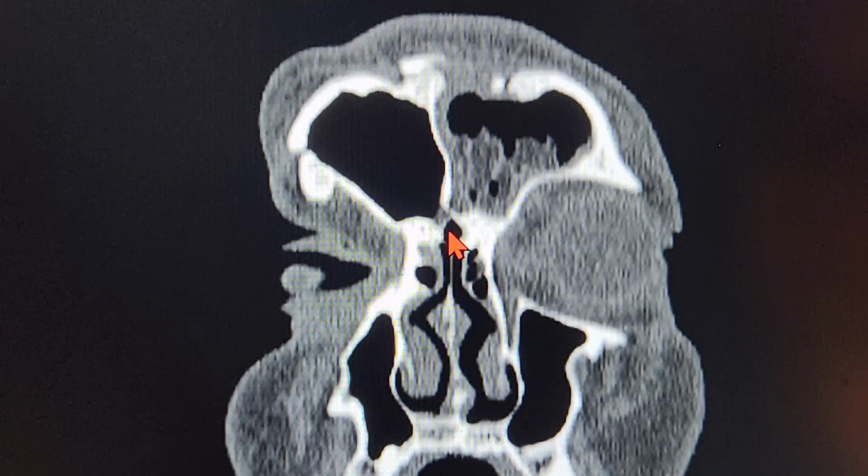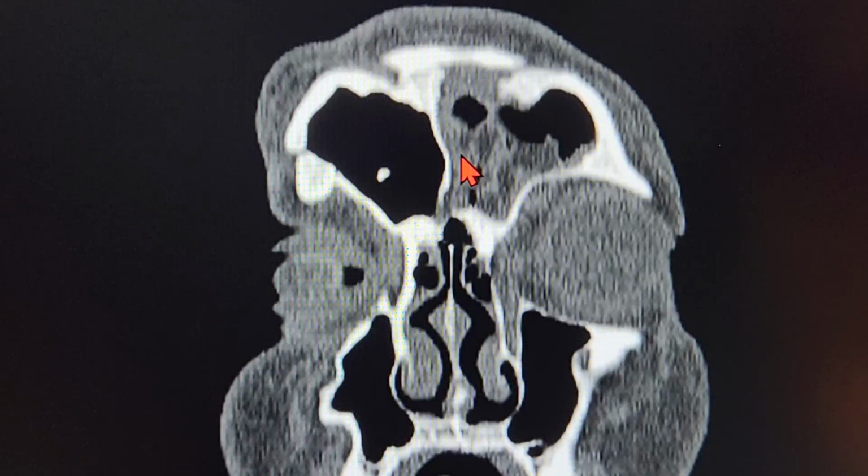As we keep going behind superiorly, you can see there's a bigger area where there is a huge deficiency of bone. Probably that's the area from the top side when the transcranial approach was done. Maybe they had gone from the patient's left side for the approach, and as you can see, there's a huge collection in the patient's left side frontal sinus. You can see some altered double density sign. It could be anaerobic infection, it could be collection or entrapment of air within, so it could be fluid, air, liquid, gas shadow over there.